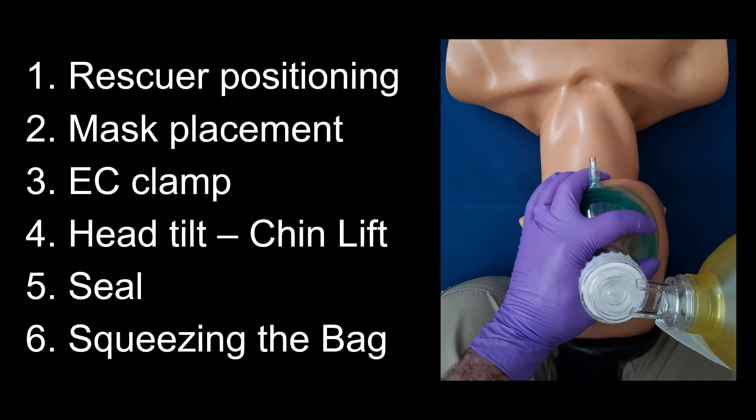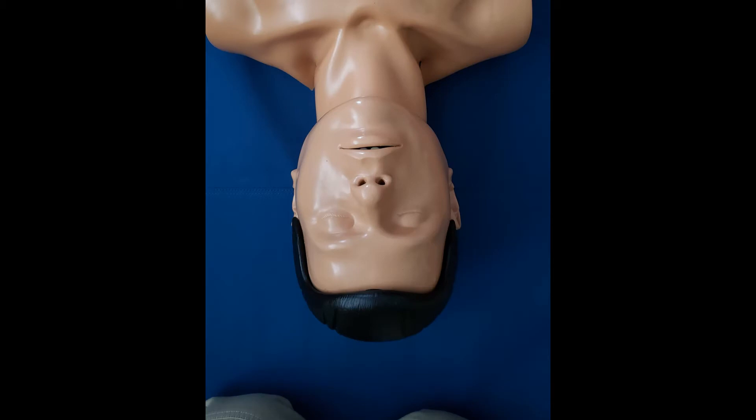The key steps are: rescuer positioning, mask placement, EC clamp, head tilt, chin lift, seal, and squeezing the bag. Single rescuer bag mask ventilation should be performed with the rescuer standing or kneeling at the top of the patient's head.